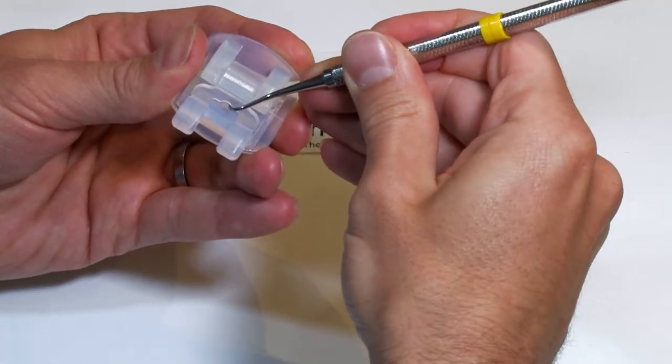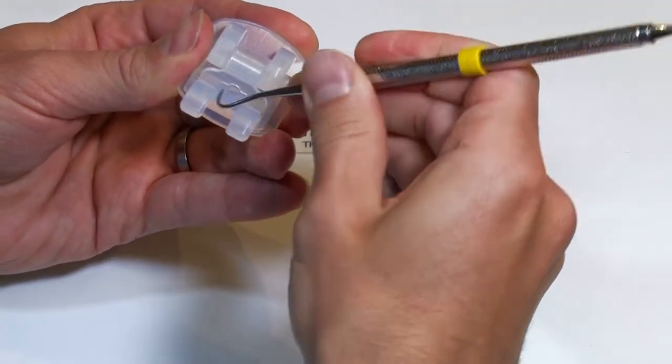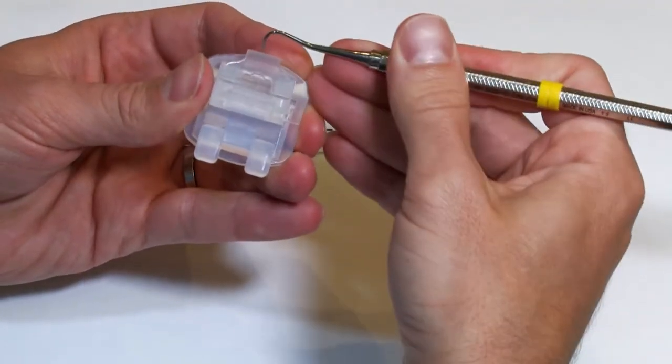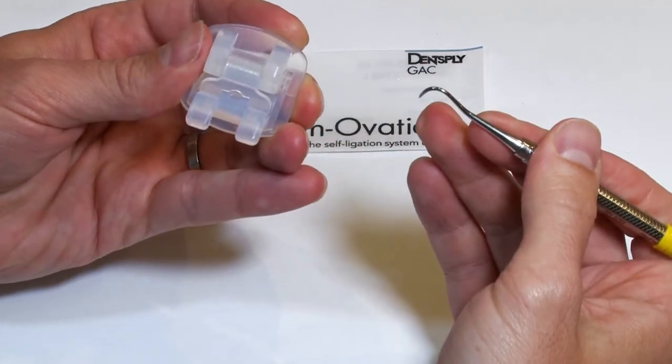You don't want to push too deep because otherwise it'll actually push that clip closed, so you want to be gently lifting up on that little opening and closing again with your finger or the scaler.